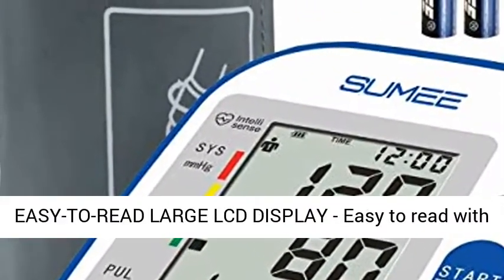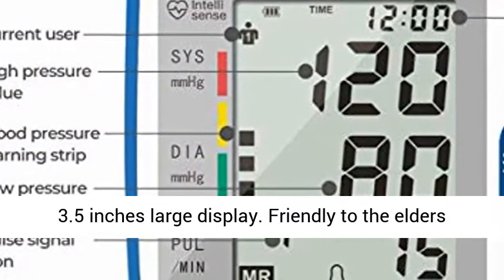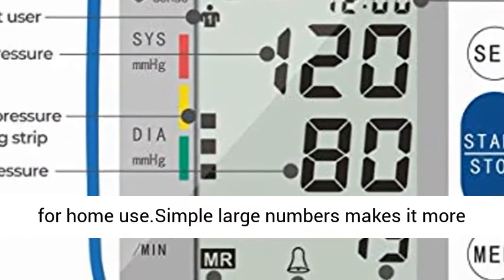Easy to read large LCD display with a 3.5 inch screen. Simple large numbers make it clearly readable, making it friendly to the elderly for home use.